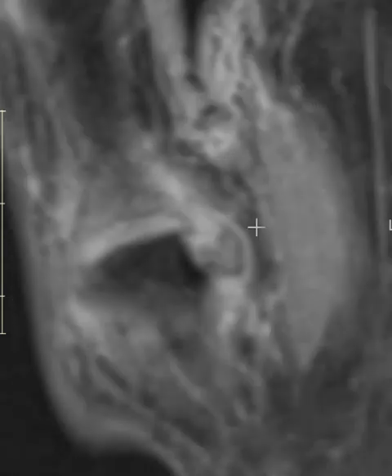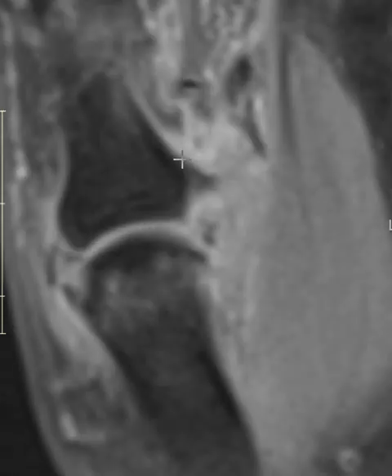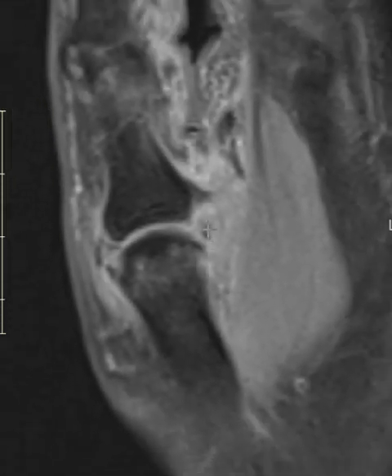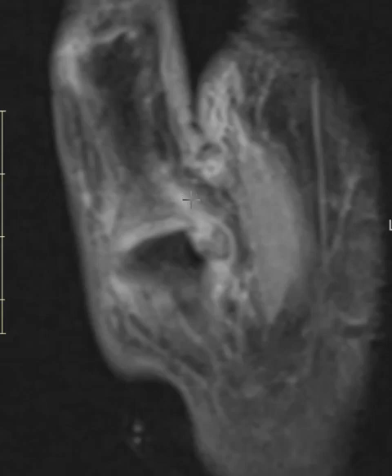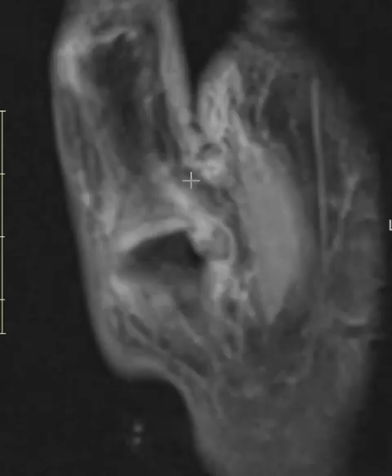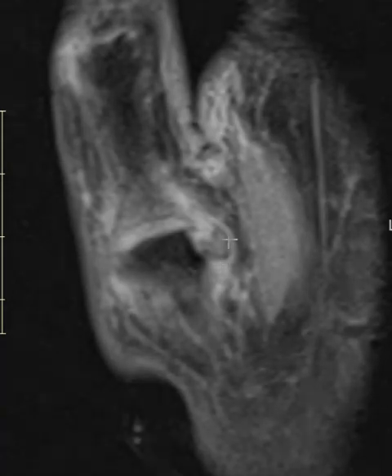This is part of the thenar muscles and the adductor aponeurosis that comes over here to attach, and it looks like it's retracted back and folded. This is not going to heal because it's not in a straight line — it's too far away from the distal attachment. This is what we call a Stener lesion, where the adductor aponeurosis is in the way.